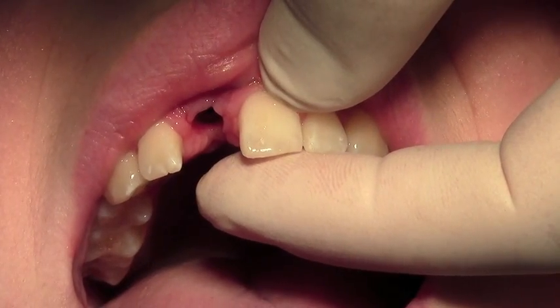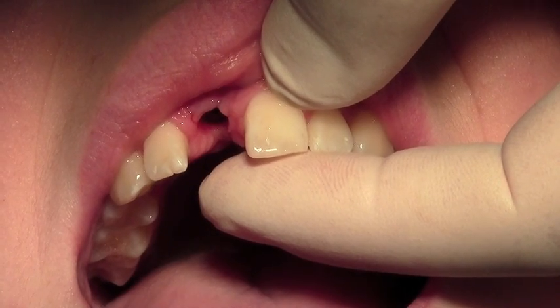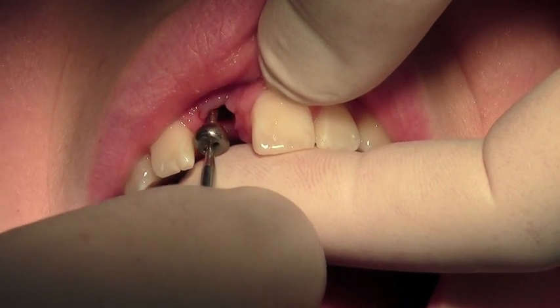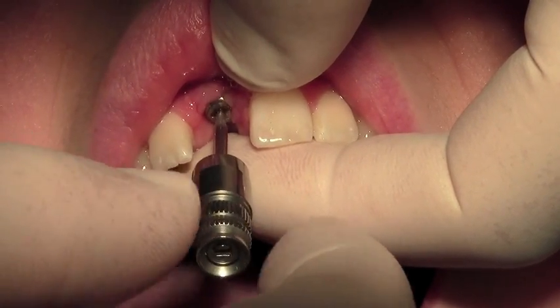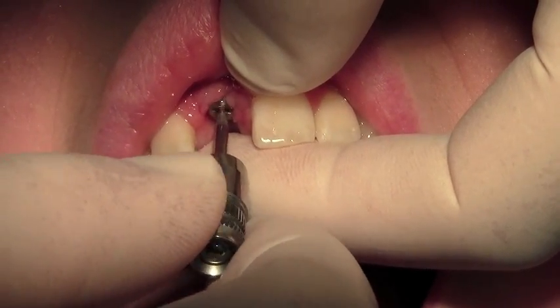I would recommend that immediately you put the healing cap back on so that the patient doesn't feel any discomfort by having a chance for the gum to close up.